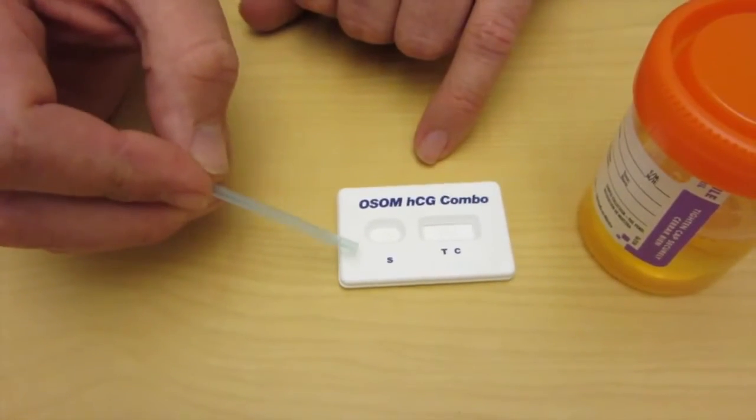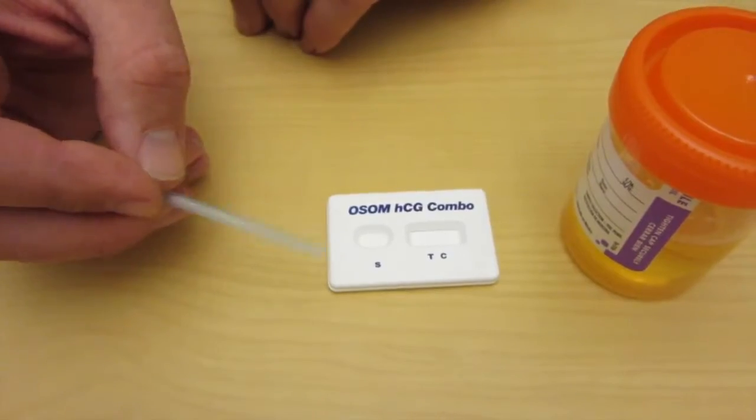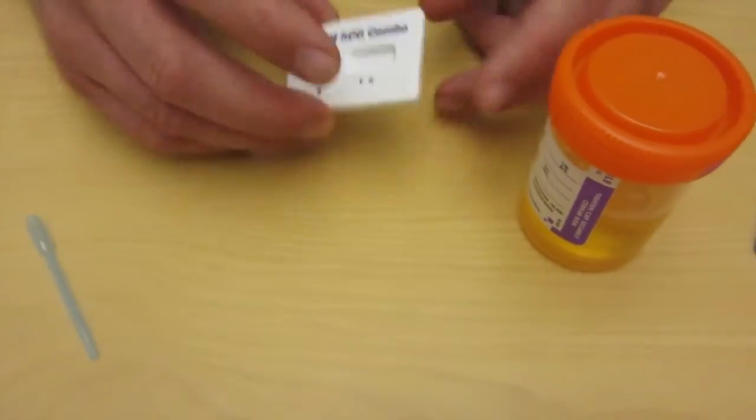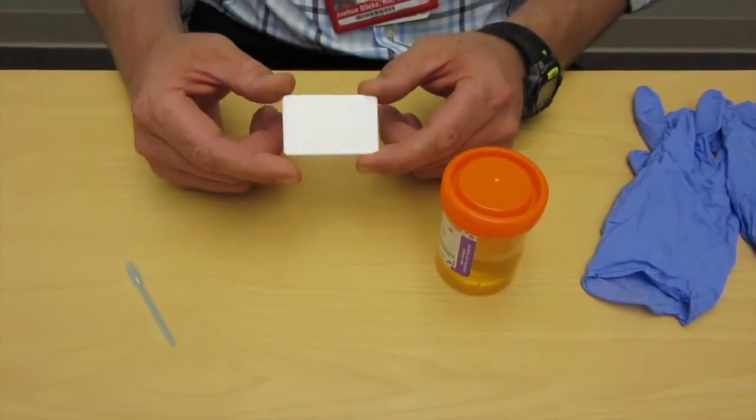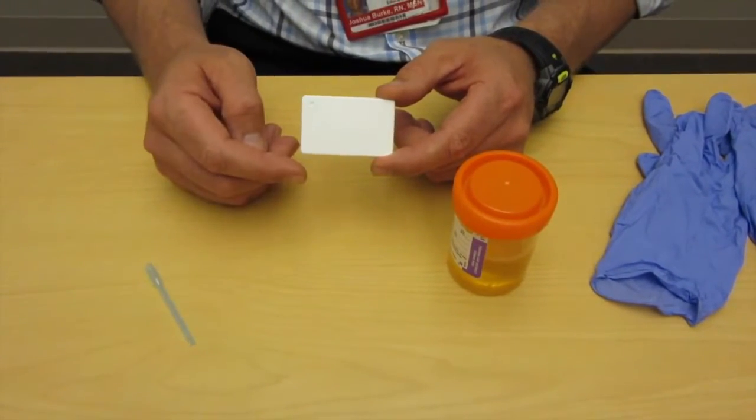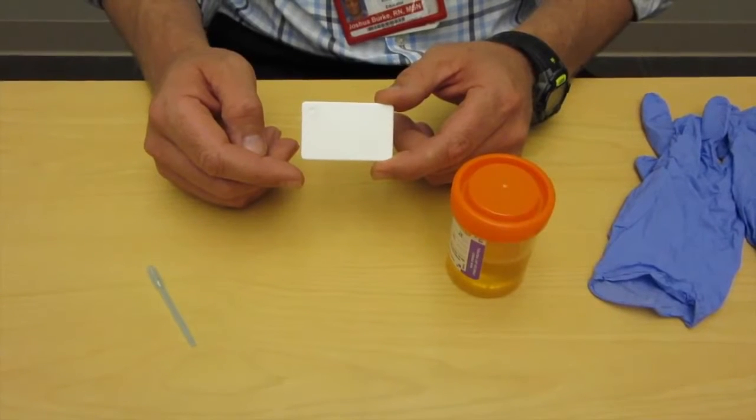If you ever leave these out of your immediate possession, it's really important to label them. You can put a generic label on the back that tells you which patient it's for. You don't want to come back and see four of these in the same test area with one person being pregnant and not know who it is.